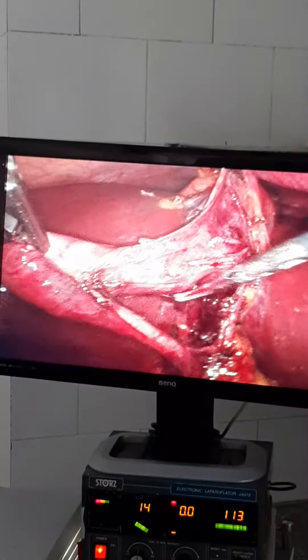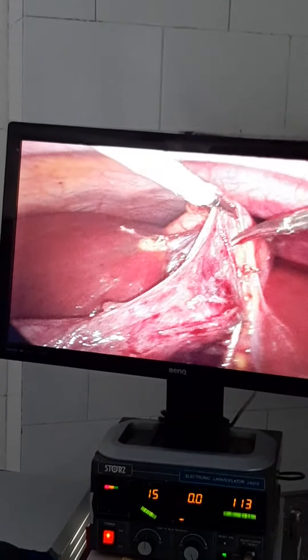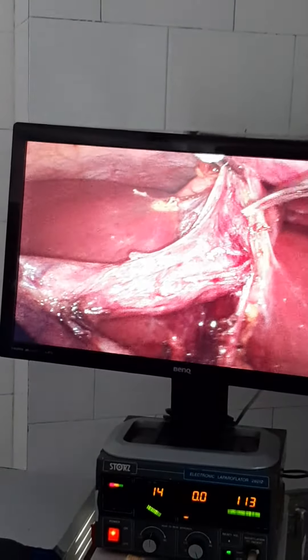This is a case of calculous cholecystitis with multiple stones here. You can see the gallbladder. We are doing a laparoscopic cholecystectomy technique.